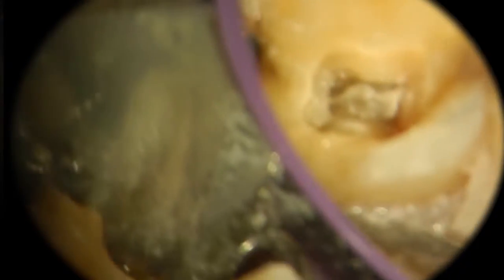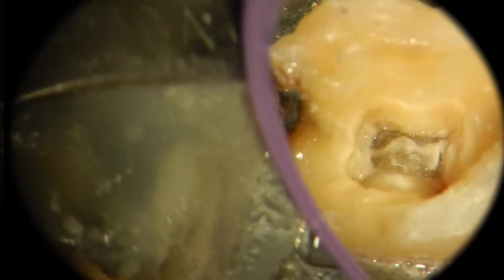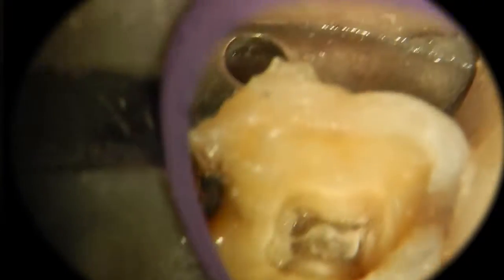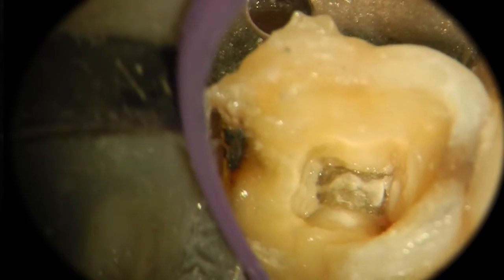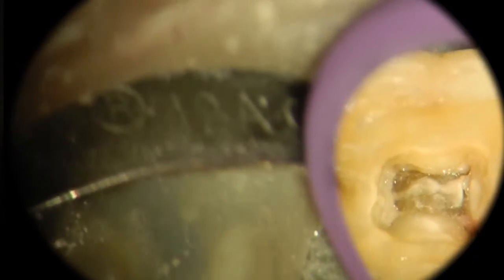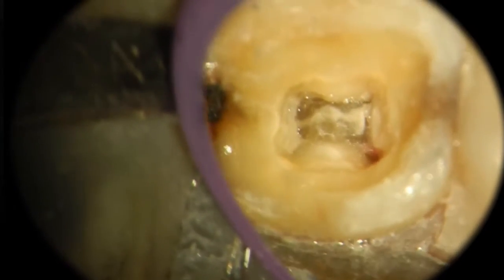See, the light always changes, and the view always needs a little bit of fine focusing, and there we're getting a better view down into the chamber. It shakes around a lot, and you find your comfort level with it. But if you're going to be doing a lot of endodontics, and we're talking about orifice exploration, you really want to think about getting yourself into a microscope. It doesn't need to be a super high-end microscope. It might even be a used microscope, or you might have the economics to go out and just buy a really nice new one, which would be way cool.